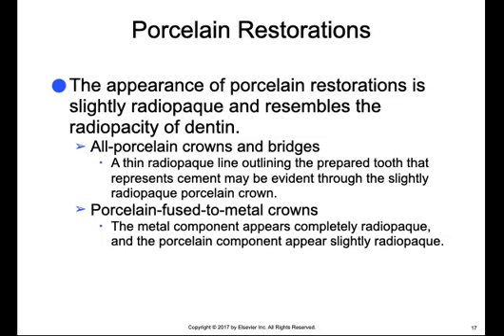And all porcelain crowns and bridges appear slightly radiopaque on the dental image, and a thin radiopaque line outlining the prepared tooth may be evident through the slightly radiopaque porcelain crown.